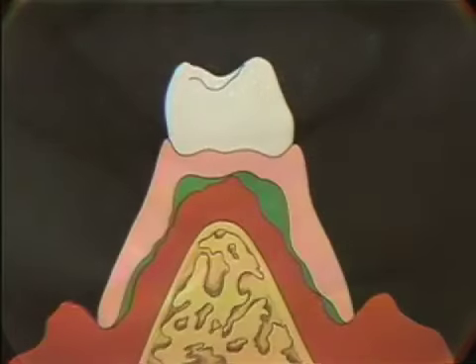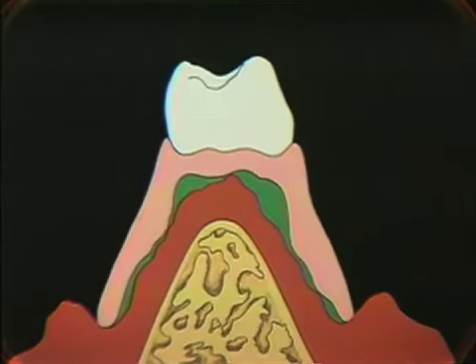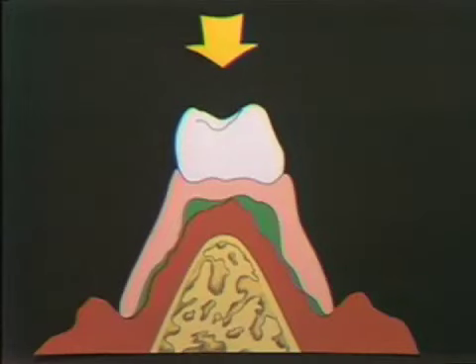If we made a base that fit this, at rest, the base would rest on the top of the undistorted tissues, and there would be voids where the ridge area was distorted, so that as we would put this base into function, it would move because it would be resting on the tissues, and it would have to distort the tissue in function in order to be a stable base. During function, the tissue is forced to fit the base.